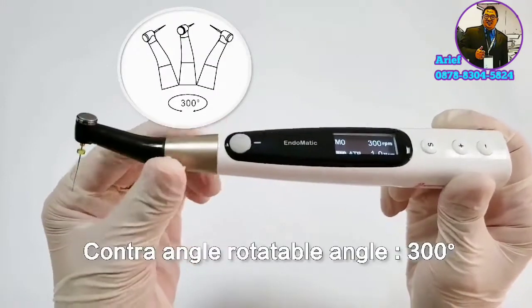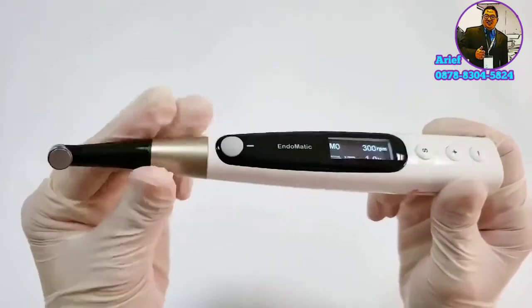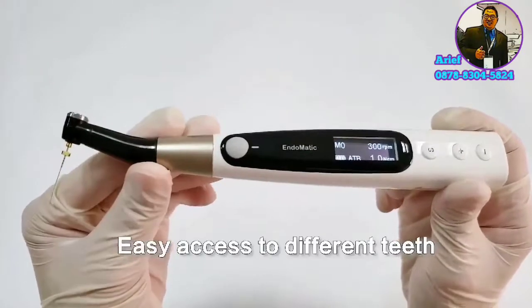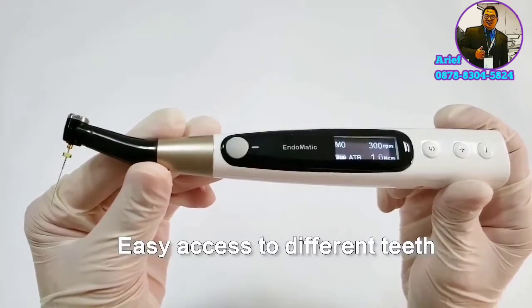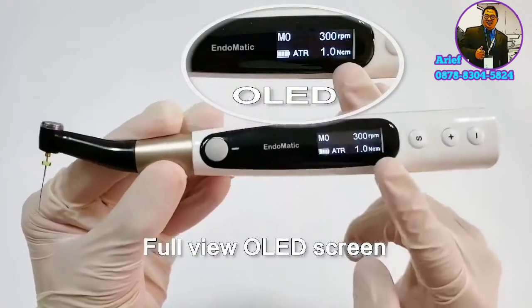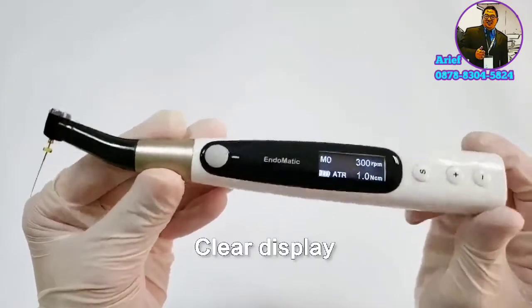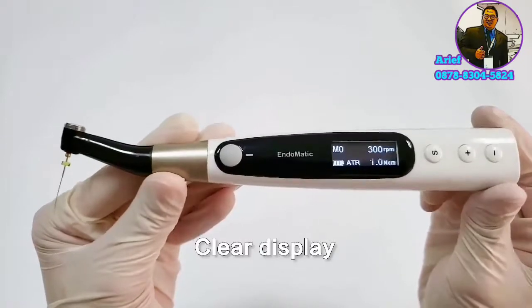This contra-angle is 300-degree rotatable, so it's quite convenient for different task preparations. Endomatic adopts a full-view OLED screen, so it's easy to see the information on the display from all angles.